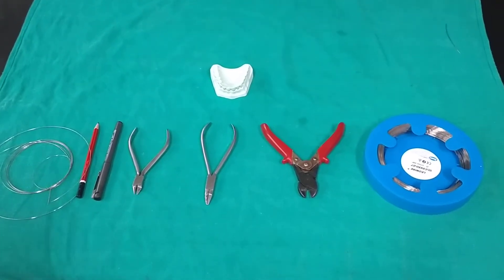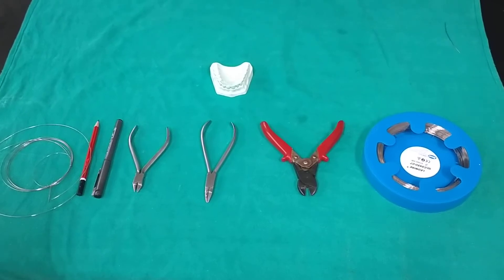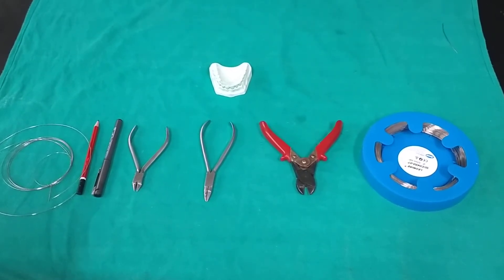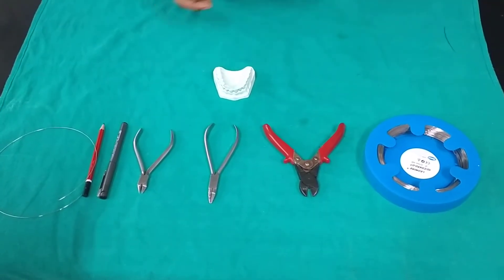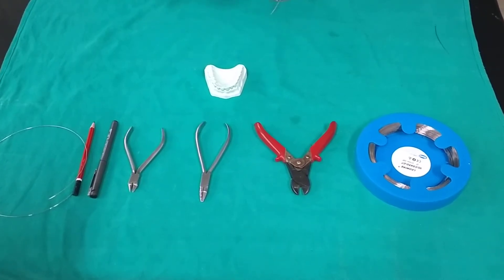Hello everyone. In this video we learn how to fabricate a Z spring, also called a double cantilever spring. It is used for correction of anterior cross bite, which can be a single tooth or a two-tooth correction.